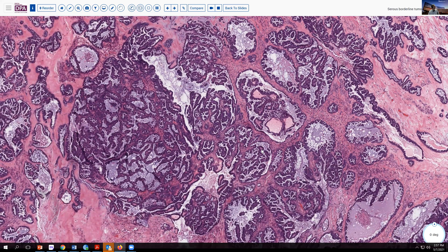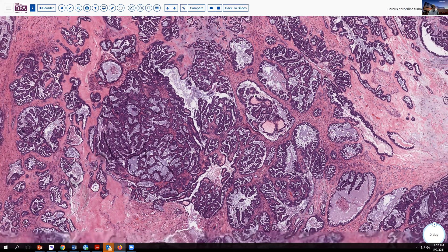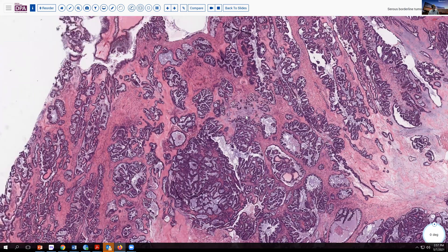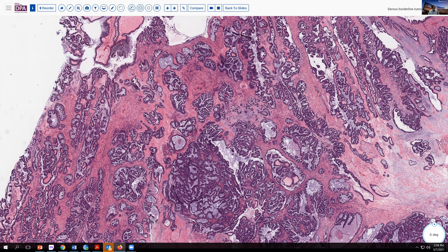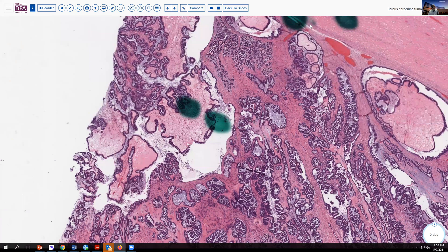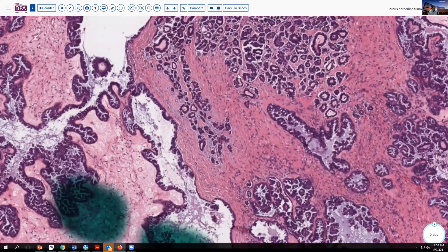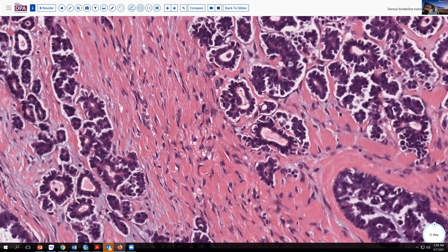Really, from the very first time the slide hits the stage, you ought to be able to identify this pattern as being a serous borderline tumor. Then you'll want to examine it at higher magnification and see if it has maybe high-grade features or something else. At low magnification there are a couple of other clues that may warrant attention. Notice this area here — that looks a little different than these other areas, so I'm going to want to look at that. And then we've got another area over here, conveniently located within the green dots of similar appearance. So we'll go down on this one right off the bat.